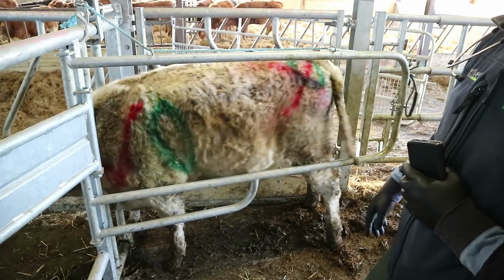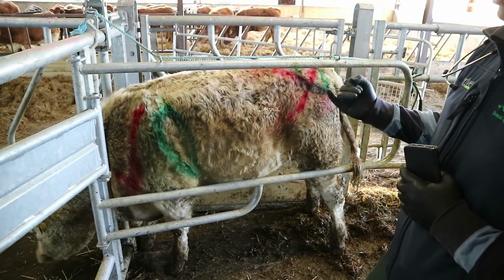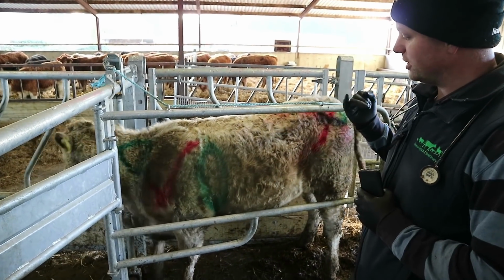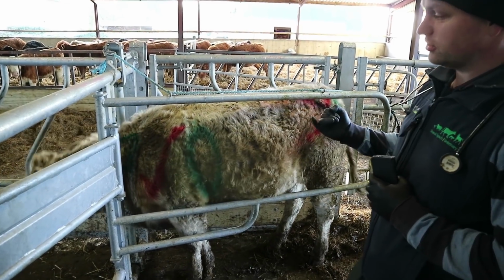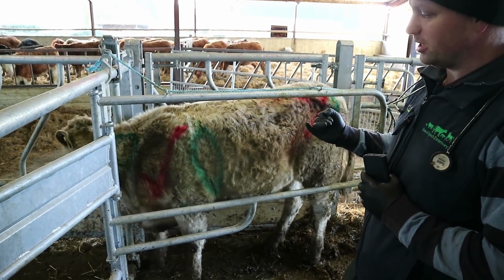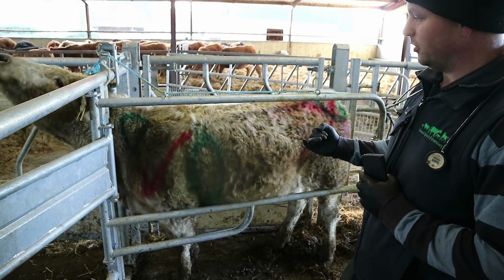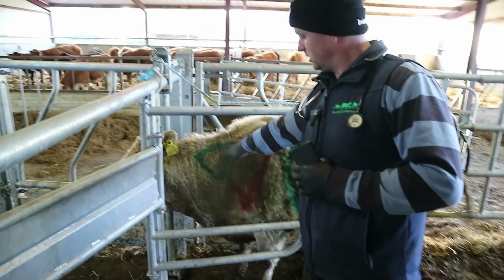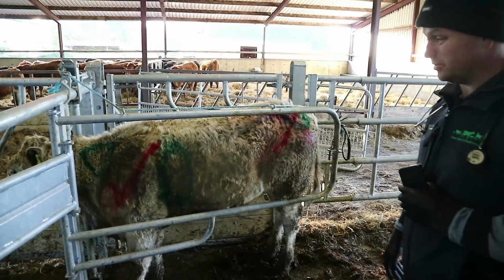Other important things to bear in mind is that when we're injecting, we should always use a new syringe, a new needle, or at least a clean syringe and new needle, and we should pick a clean site of the animal to inject. So if there's an area of the neck or the rib cage that's contaminated with feces or other dirt, we'd certainly avoid that area and we'd pick a clean spot to inject. So as you can see here, this triangle, this part of the animal is nice and clean, and generally it will be clean in most animals.